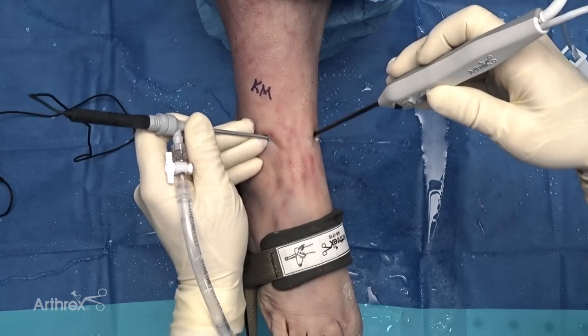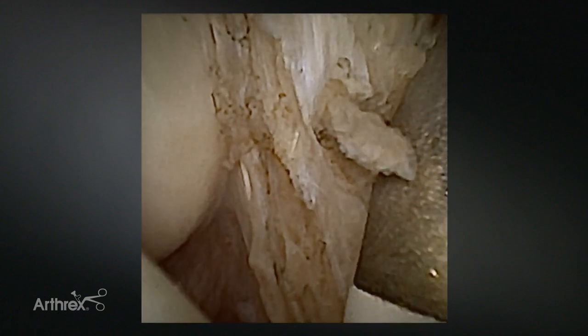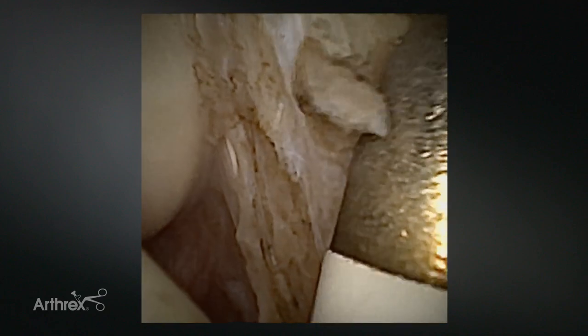Nano needle also provides the ability to look deep into the medial gutter, allowing evaluation of the deltoid. If you suspect deltoid injury during lateral ligament reconstruction, it allows you to look over here quickly, examine the deltoid, and see if there's a component to deltoid injury as part of ankle instability. I frequently use this to assess the articular surface and ligamentous structures medially and laterally as part of my standard internal brace protocol.